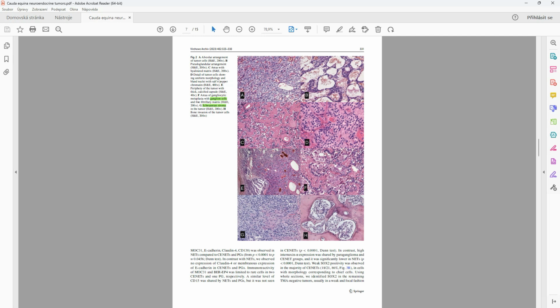Sometimes you may have this vascular invasion. It means nothing. There are no cases reported which metastasized. Maybe one or two cases recurred, maybe after incomplete resection. So it's a completely benign lesion. And importantly, what is most important to use in differential diagnosis, GATA3 immunonegativity and cytokeratin positivity distinguishes that from metastatic paraganglioma.